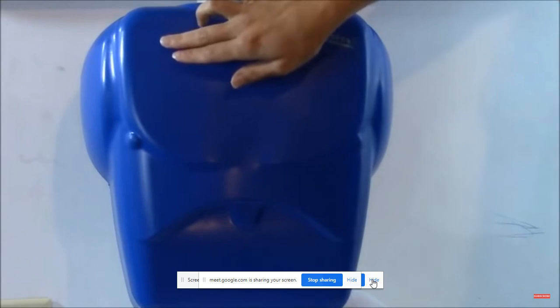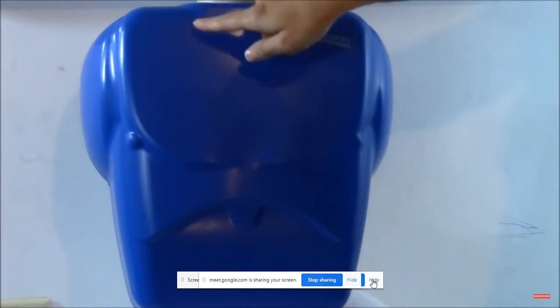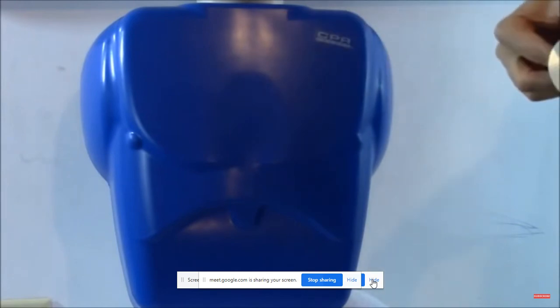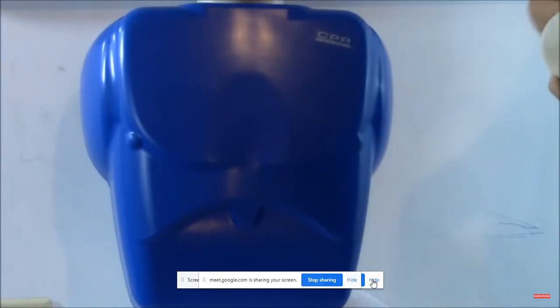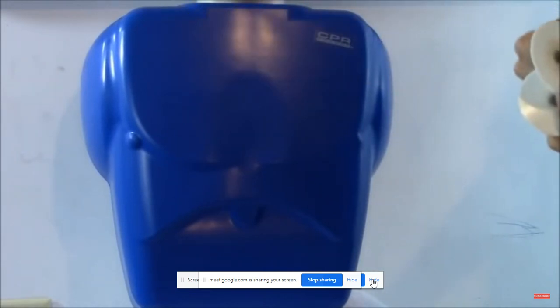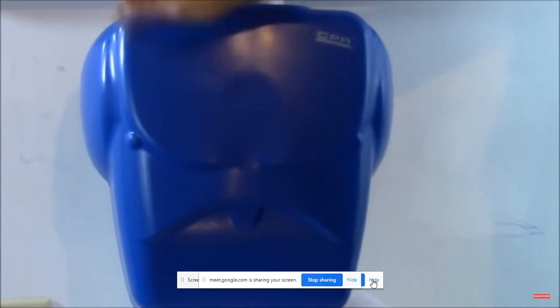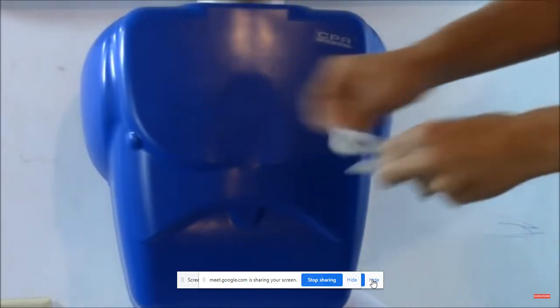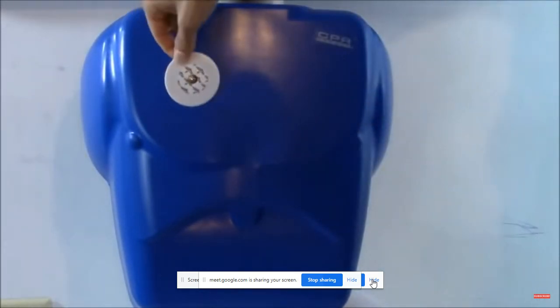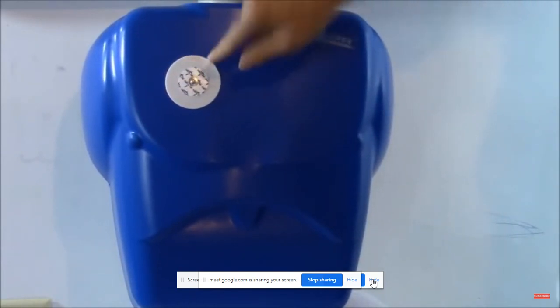So your right arm lead will go in the second intercostal space of the ribs, so about right in this area. And how you want to prep the skin is you want to take your alcohol prep and you just want to clean the skin really good, get those oils off, and then lightly take your exfoliation paper and just scratch on the area lightly just to rough it up, and then peel the backing off of your electrode and place it on the skin. And make sure you put it down really well.